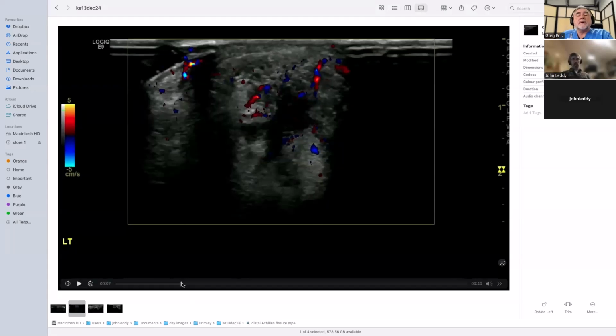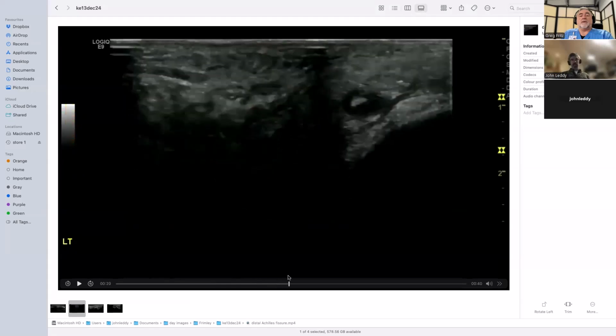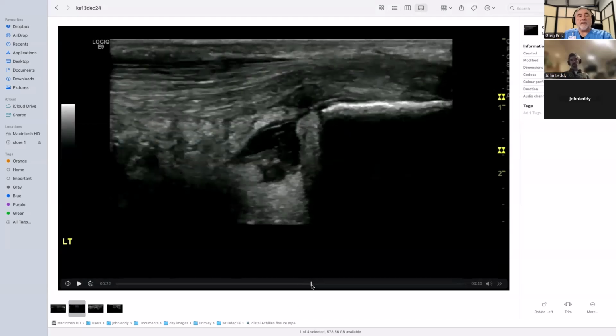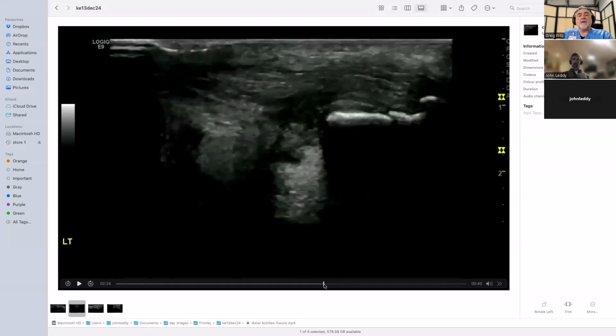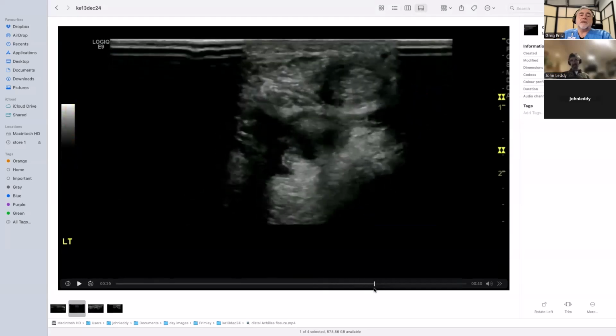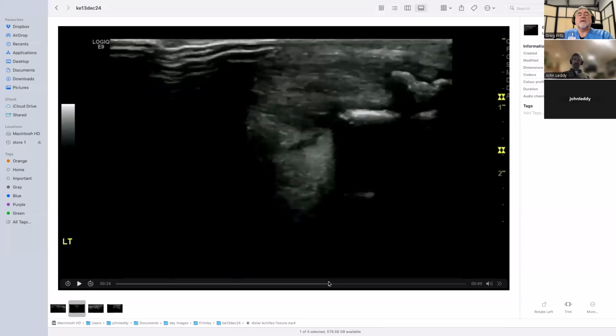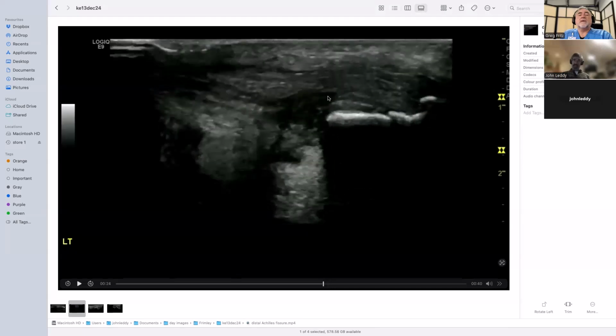If we go back to our picture of the bursa, this is probably to some extent fluid here. Yeah, some of it will just be very low echo material, and some of it will be fluid. And the question is, if this dark area extends into the tendon, is this a tear in the tendon that is then having synovial fluid infiltrating into it, or is this just tendinosis within the tendon?